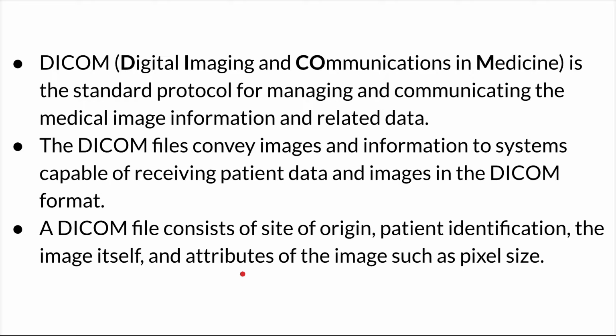So there are two things combined here: the digital imaging and the communication in medicine. It's a standard protocol. Protocol means rules, okay? It's for managing and communicating the medical image information and related data.